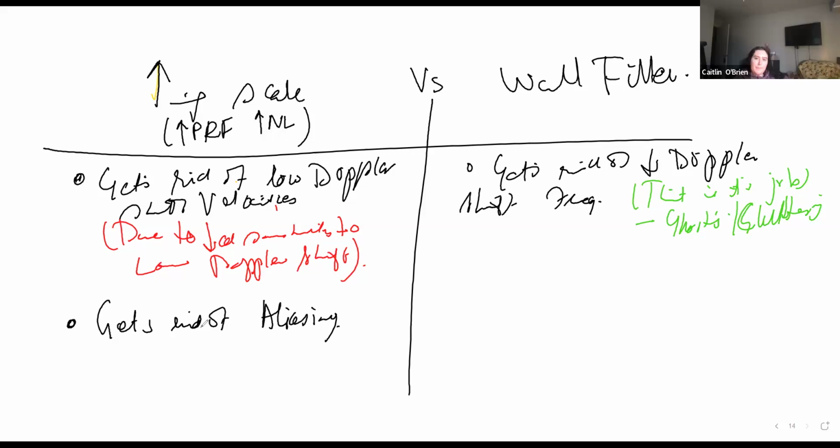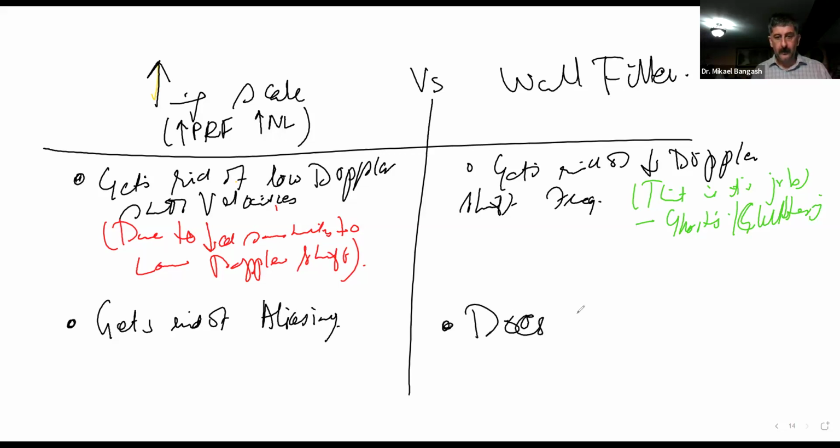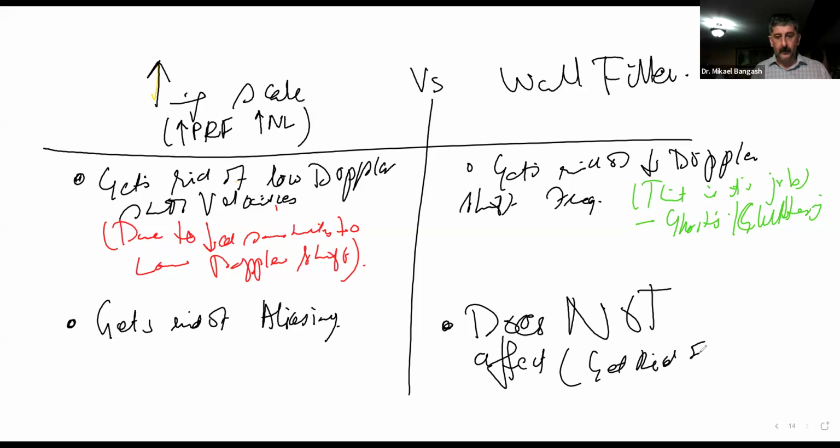Yep. Okay. Whereas, as far as aliasing is concerned, your wall filter does not affect it. Forget about getting rid of aliasing.